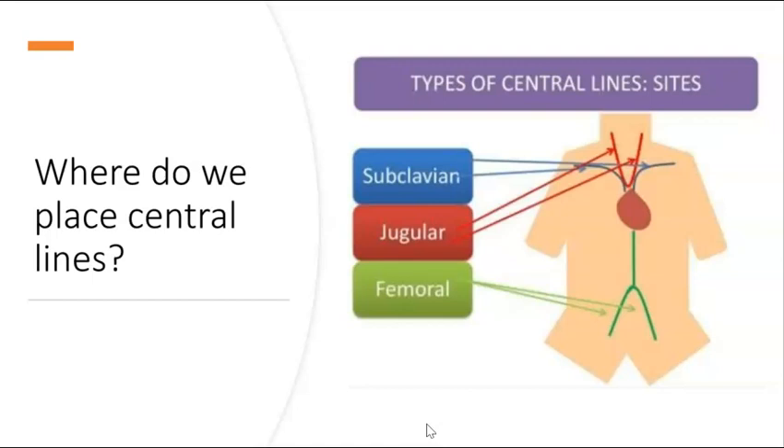Central lines can be placed in one of three locations: the subclavian vein, the internal jugular vein, or the femoral vein. In this video, we'll be placing the central line in the internal jugular, as this is the most common location.